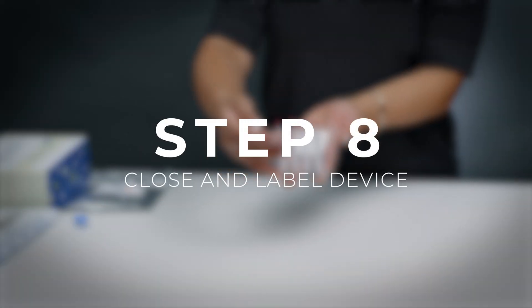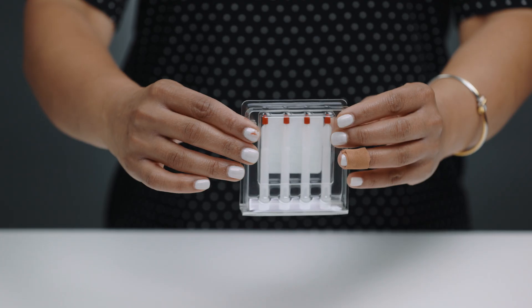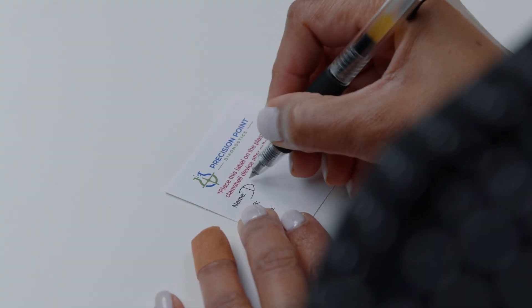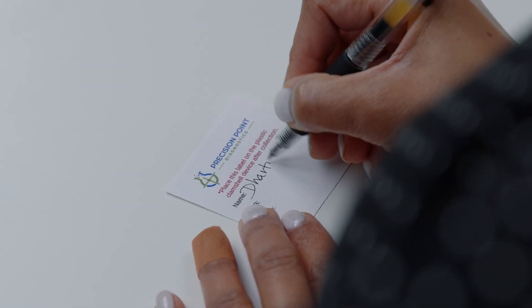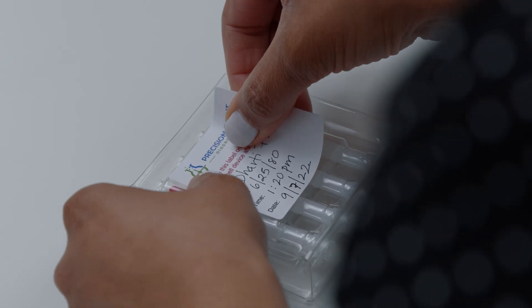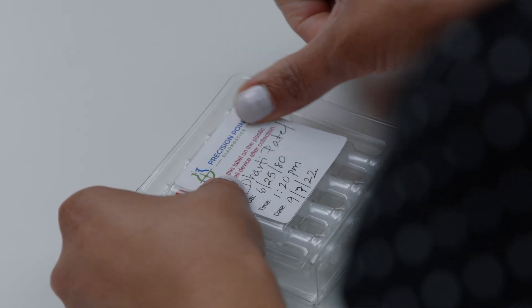Step eight: now you can close and label your device. Just lift the sides to meet at the top, press together until a click is heard, and place your label sticker on the clamshell. Make sure you label your name, date of birth, collection date, and collection time.